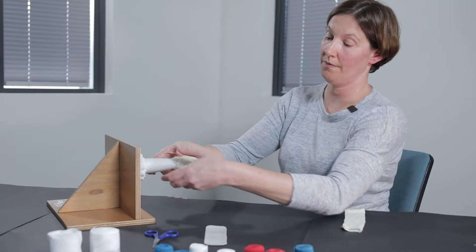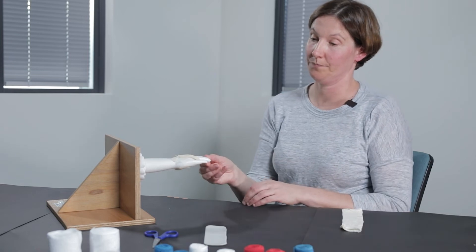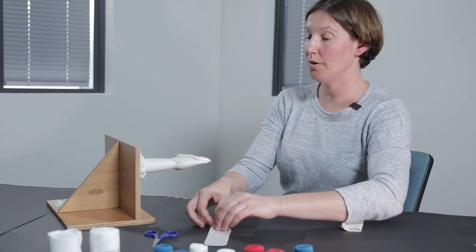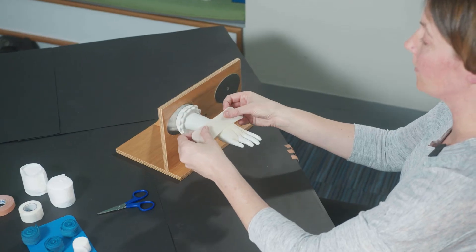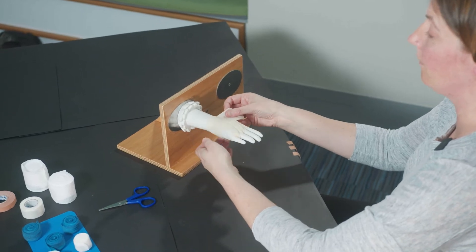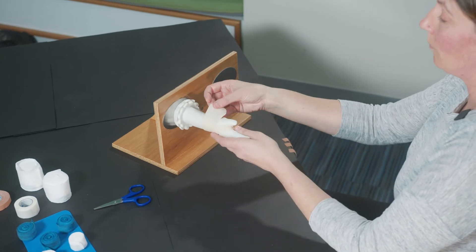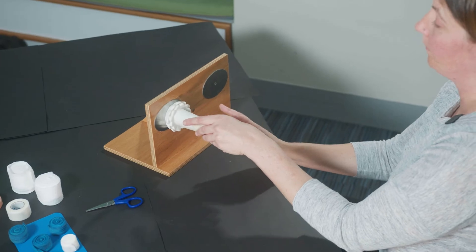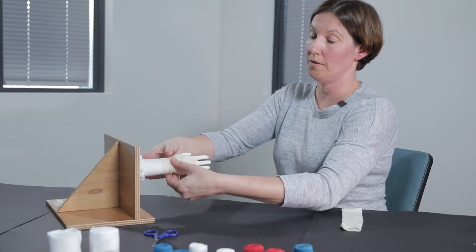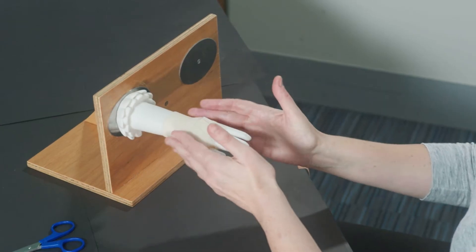Once you have that in place, we're going to start with our soft dressing. The other place you may need to add a soft layer prior to doing your bandage wrapping is around the wrist — this helps to provide a level of protection to the wrist when we're wrapping with our soft bandages. Just a very gentle layer there, and our soft wraps are going to then be placed on top of this wrist piece.